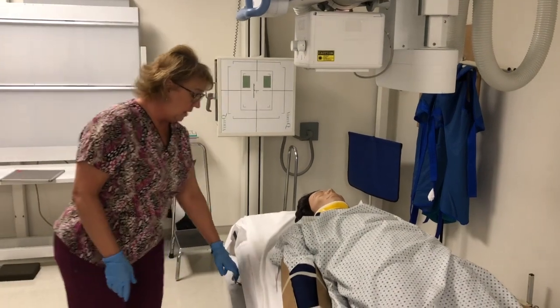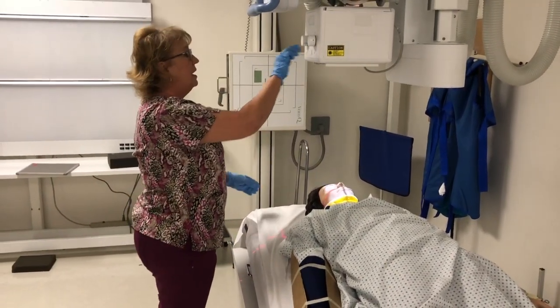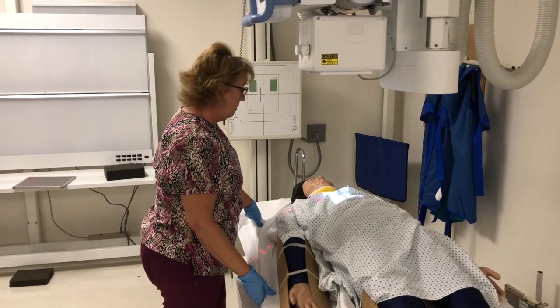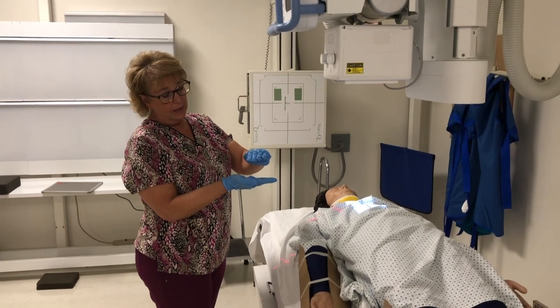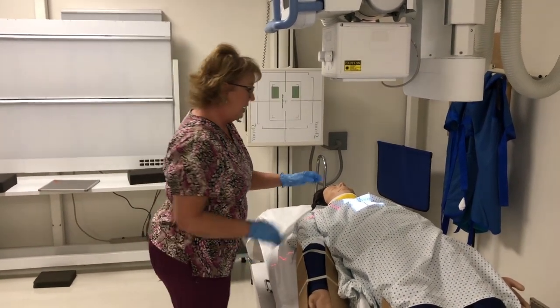So we're moving on to our AP thoracic spine. I have my 14 by 17, my right marker. You'll notice that I'm at a little bit longer SID because typically trauma patients are on backboards, which elevate them off the table. And so you need to increase your SID to compensate for that.